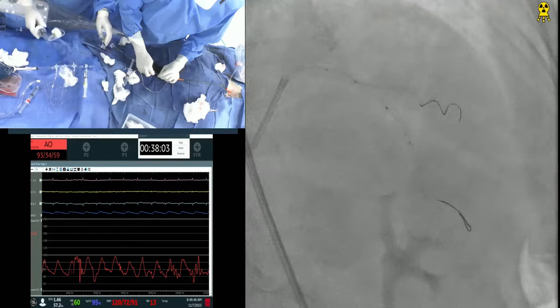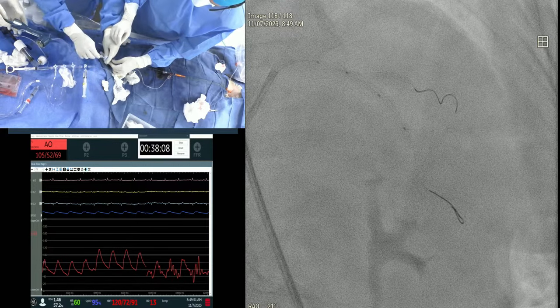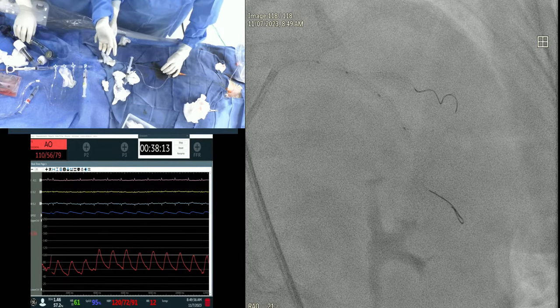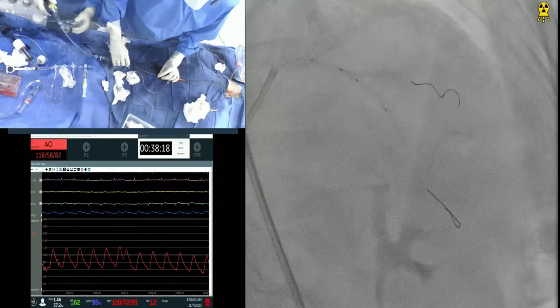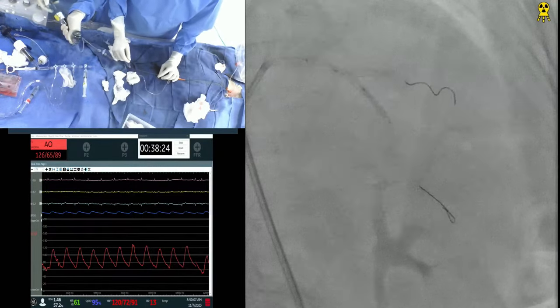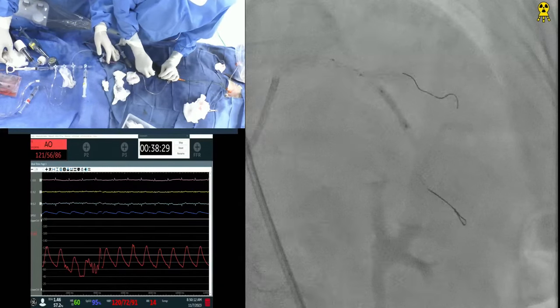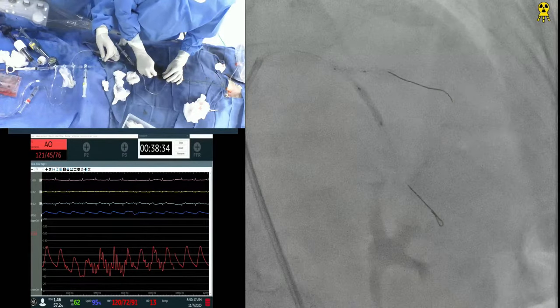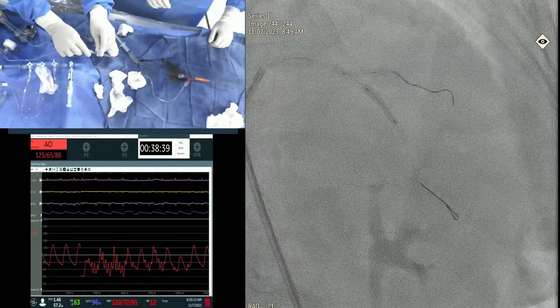Now, be careful here. Gentle. So just keep it nearby. Don't go that far. Also, I have a new 2.0 balloon ready. Maybe a trouble. Okay, I'm going up now. Remember, you cannot have it that. Good, okay, go. We're going low pressure here, about 8. Good. Don't open. Have it ready. Okay, good. Going slowly. Good. I think it's a nice demonstration. You saw that? Excellent demonstration.